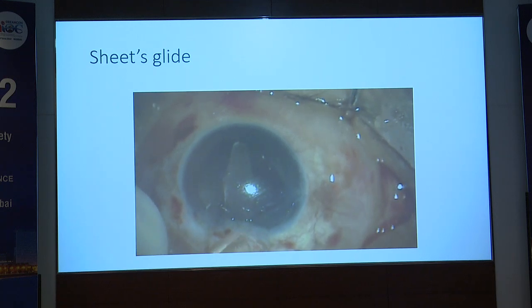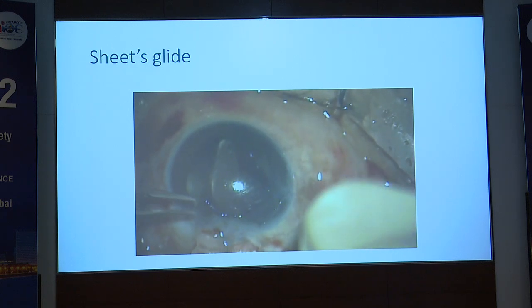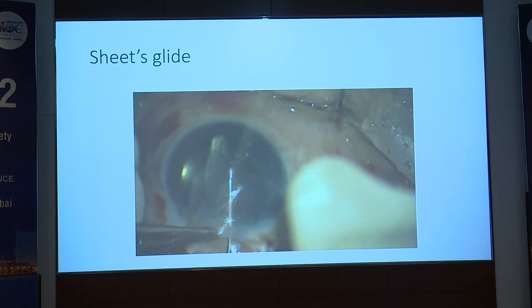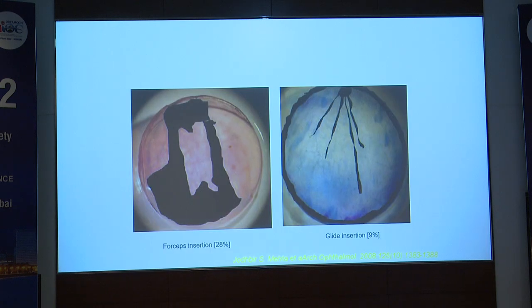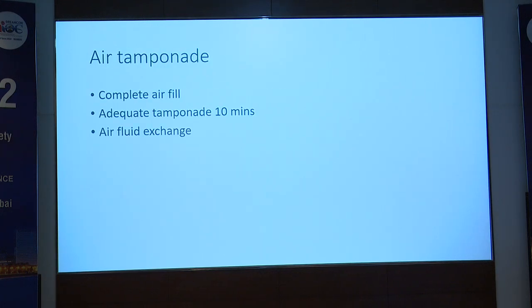Any cataract surgeon who's well versed with inserting an IOL can insert the DSEK lenticule into the anterior chamber with the right side always down. That's the endothelial side down. And with the glide, you can see that endothelial cell loss is quite minimal, and it gives good results as well. So again, choose one method, master that by repeatedly doing the same method.